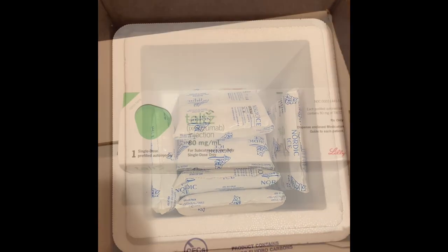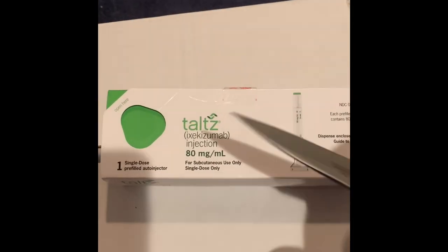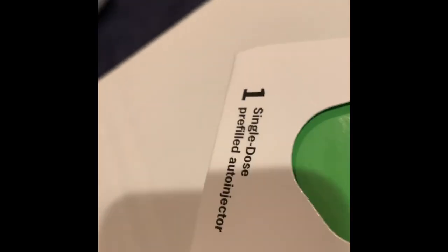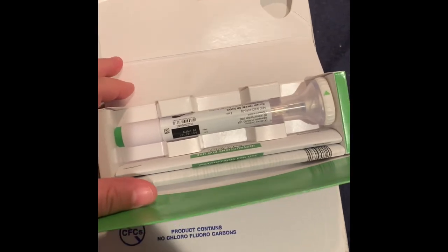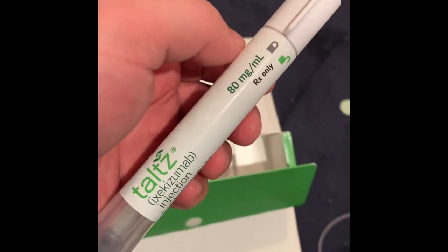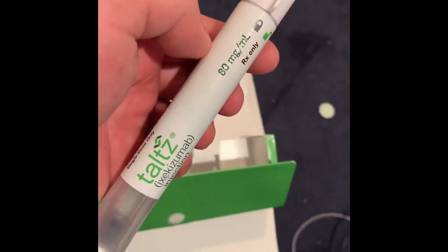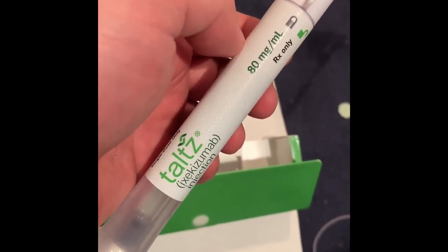Here we are again with the actual injector pack. You can see what the injector pretty much looks like. It is a sealed package, so I'll use my trusty Kershaw pocket knife to pop that seal. You open up the box and just like Christmas time — voila — there she is. It's a pen, nice and cold because it's been transported in a box with a cooler and ice packs. This is an 80 milligram pen. The dosage depends on your body size and mass — that'll be up to your dermatologist.